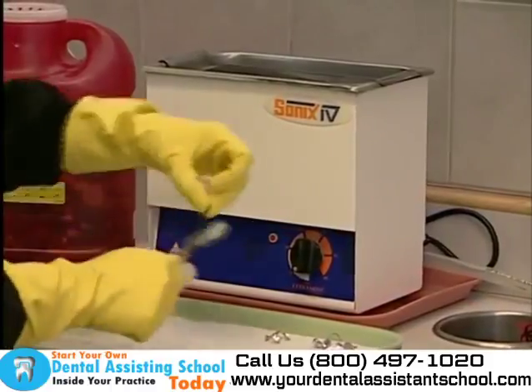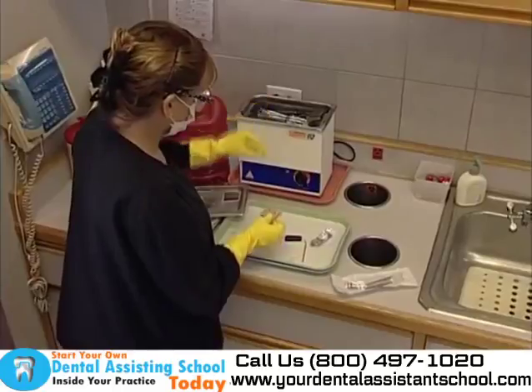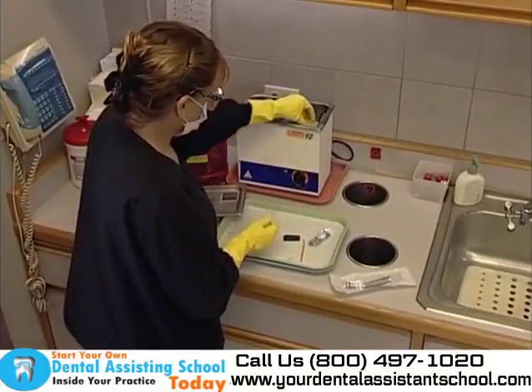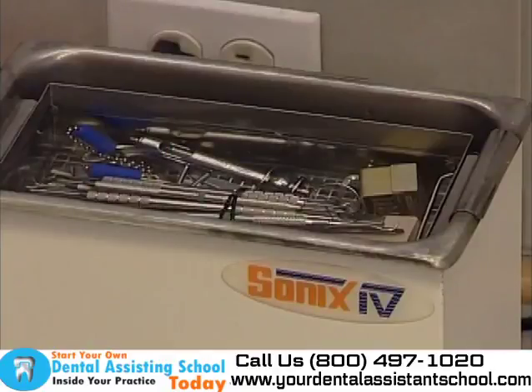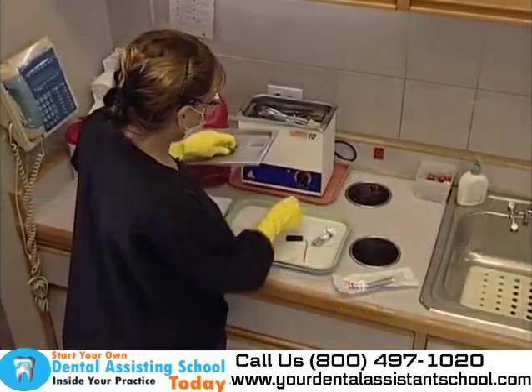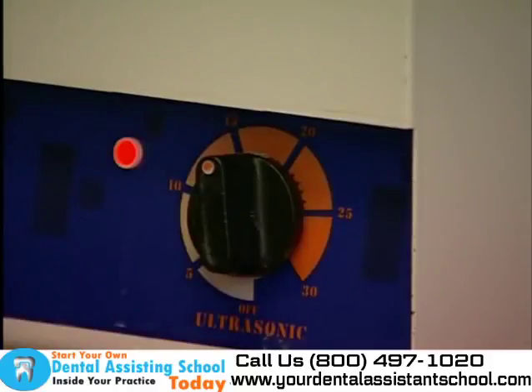When using an ultrasonic cleaner, the dental assistant places the dirty instruments into the ultrasonic's basket. For proper cleaning, all instruments must be fully submerged in the solution, and the basket must not be overfilled. If the basket is overfilled, the instruments will not be cleaned. The lid is then closed, and the ultrasonic cleaner is turned on. The instruments remain in the ultrasonic for approximately 15 minutes.